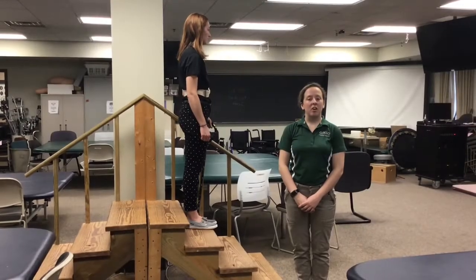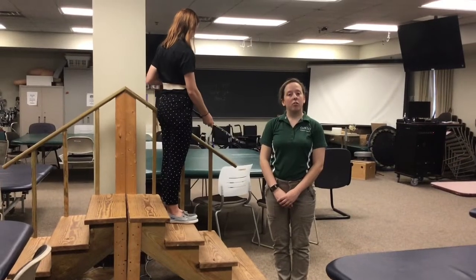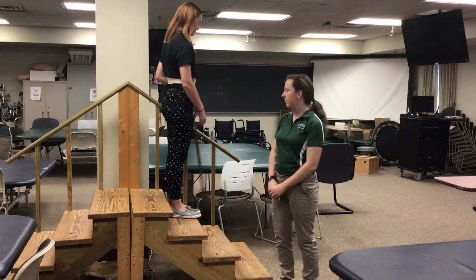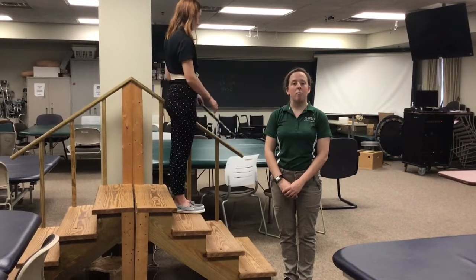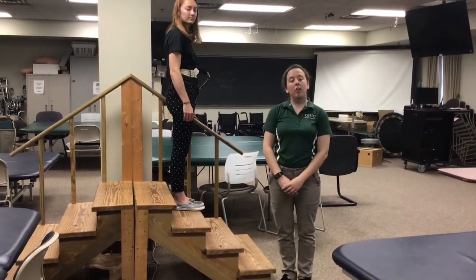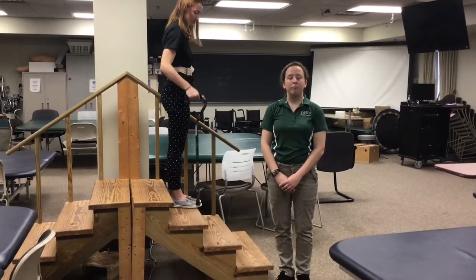There are three ways that your patient can hold their cane while on stairs. Your patient can either hold their cane parallel to the stair at mid-shaft, or they can hold it perpendicular to the handrail at mid-shaft. Your patient can also choose to hold the cane on the same side as their involved extremity.